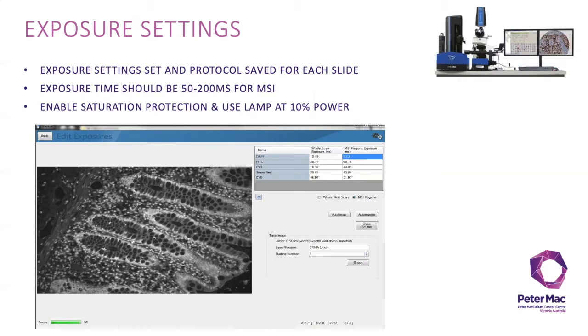For optimized panels, exposure time should range from 50 to 200 milliseconds for MSI regions. Make sure to always enable saturation protection. This protects against unexpectedly bright signals by reducing exposure if necessary. InForm then adjusts for differences in exposure times at each wavelength in unmixing, ensuring results can be compared between samples.